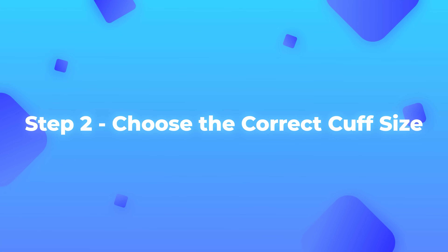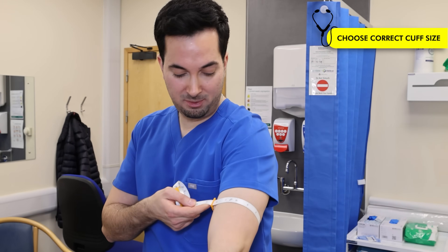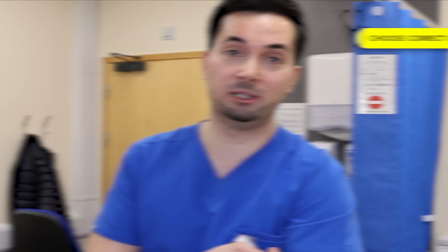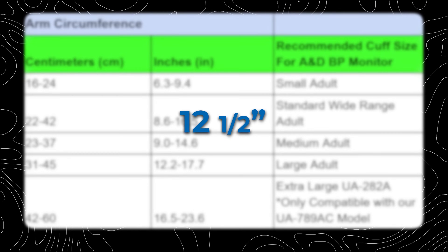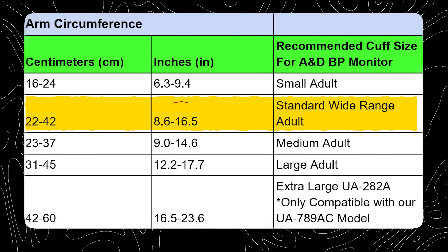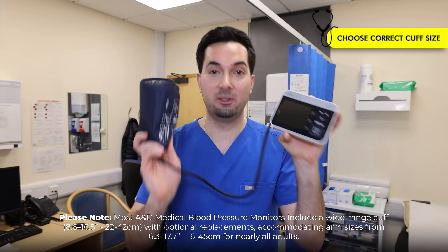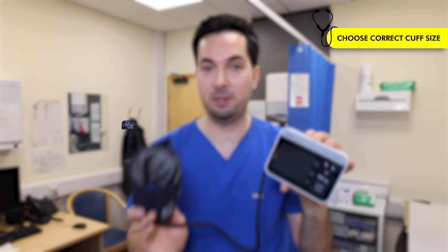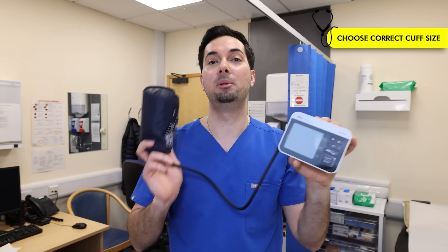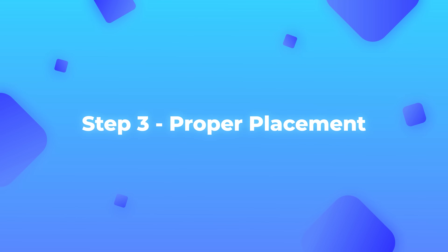Step two: now that you've found your midpoint, measure your arm circumference. Wrap the measuring tape around your arm at that midpoint — my arm is about 12 and a half inches. Looking at the A&D Medical blood pressure cuff table, 12 and a half inches fits the standard wide-range adult cuff, which covers 8.6 to 16.5 inches. Most A&D Medical monitors come with this standard wide-range cuff. Small and large adult cuffs fit other machines, but the extra-large cuff is only compatible with the UA-789AC device.